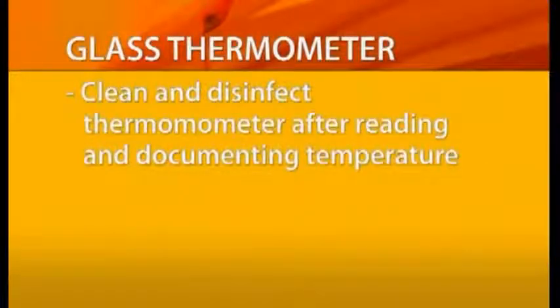Wash the thermometer with soap and water and disinfect following your facility protocol. Do not use hot water as it could break the thermometer.